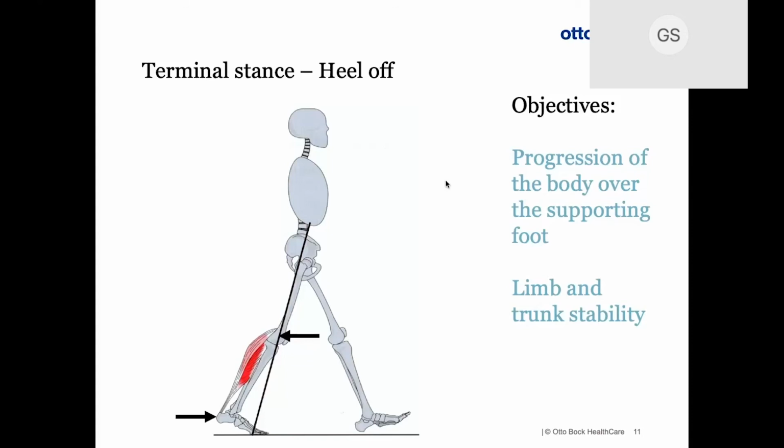Now, this is what's so essential, either we're talking prosthetics or orthotics. What we talk about is a thing called effective foot length, carrying the support all the way to the toes. I'm reminded some years ago when I was watching someone walking, she was walking in her sandals, and I noticed that the toes abducted in the sandals.